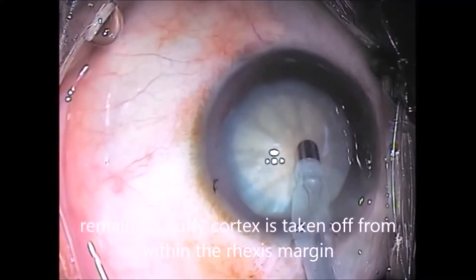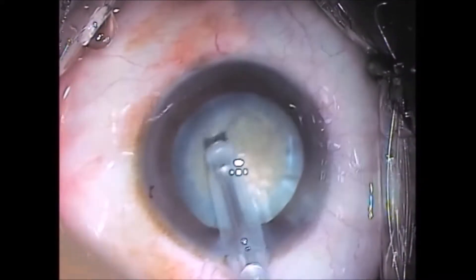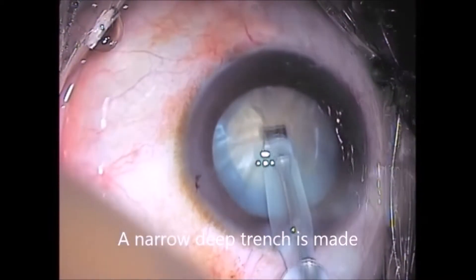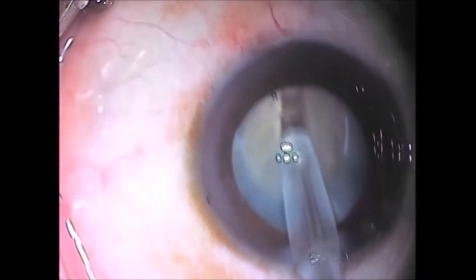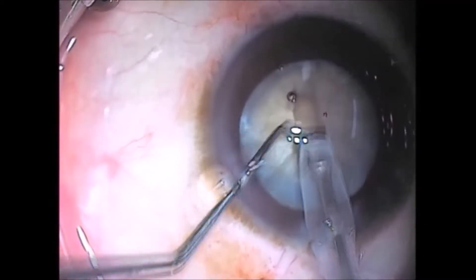Phacoemulsification is started. Cortex is taken off first. A standard stop and chop technique is used. A long deep groove is made because the cataract is pretty hard. And now it is cracked.